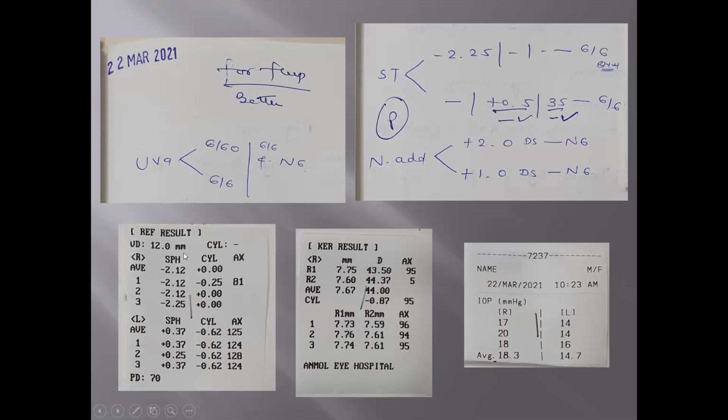And if you can see, no cylindrical power. Cylinder is visible on keratometry, that is 0.87 diopter at 95, which is also not so significant. His intraocular pressure in the right eye is also normal, 18.3, in the left eye 14.7. So the final refraction in the right eye was minus 2.25 for distance, that will give him 6/6 vision, while in the left eye the 0.5 diopter cylinder at 35 degrees will give him 6/6, but it is not required to give, as the patient is having unaided 6/6 visual acuity.